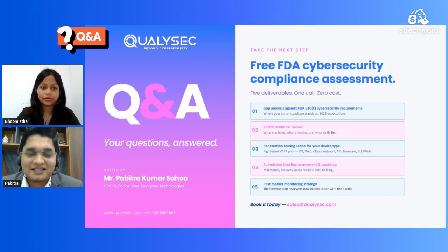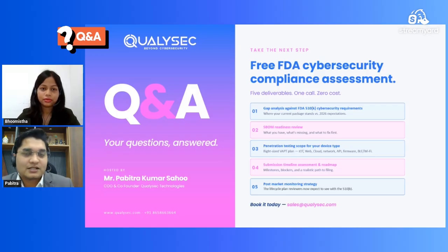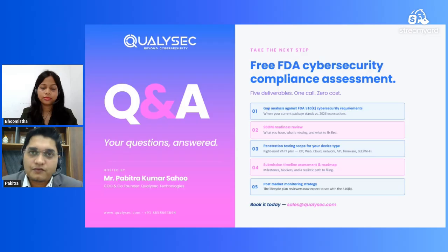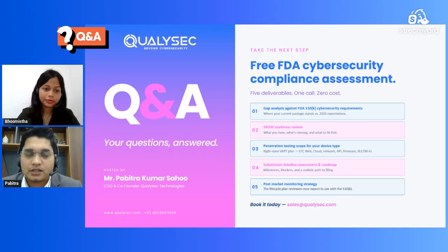Yes, that is actually the main reason. The FDA gives a lot of importance to the SBOM. SBOM is an integral part of security. So yes, if there is an incomplete SBOM or a very standard approach to it, then the FDA will definitely reject it.